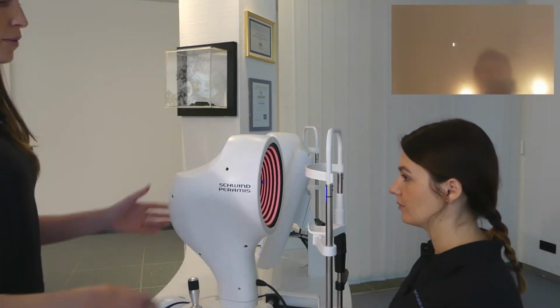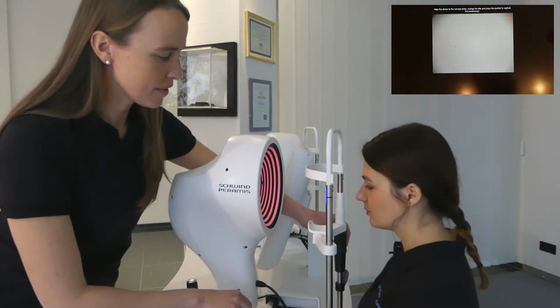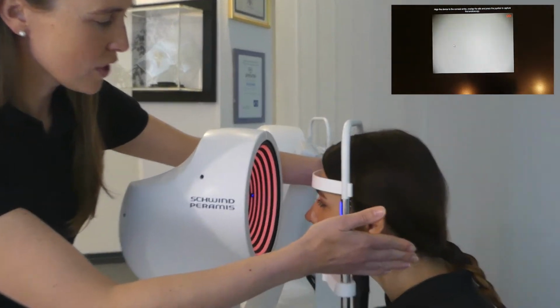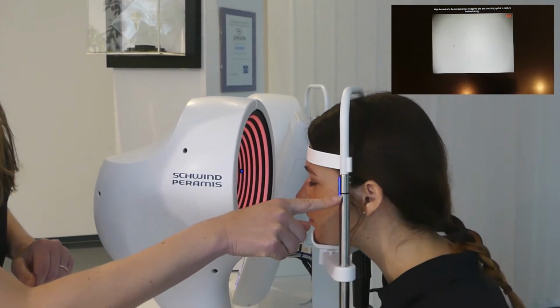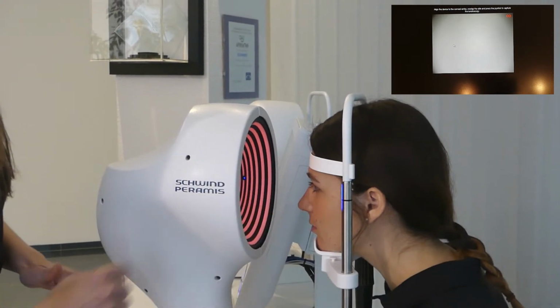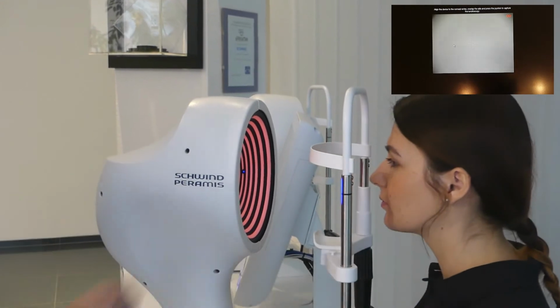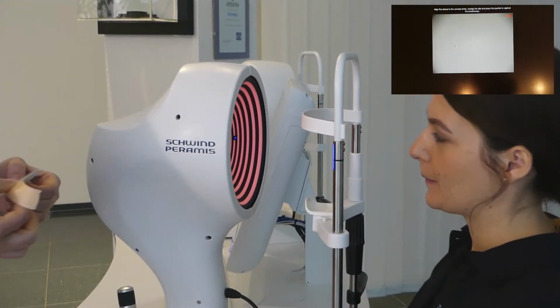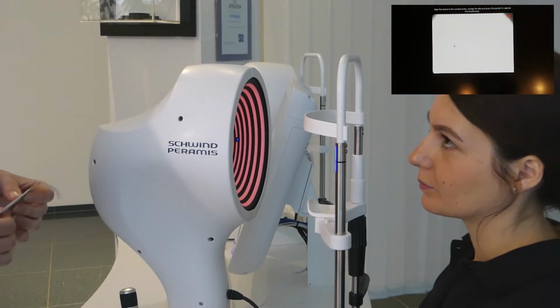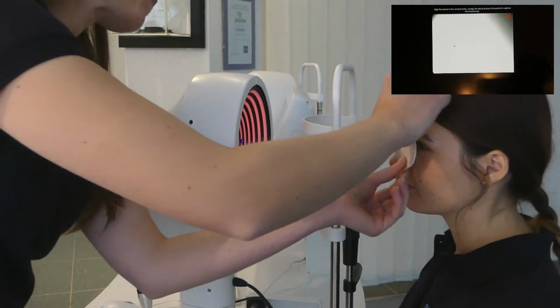Now you position the head of your patient in front of the PERAMIS device, just for checking if at first the height is correct. So this black ring should be at the height of the eye of the patient. Then patient, just go back for covering your eye, because at first I measure the right eye of the patient and therefore I cover the left eye.